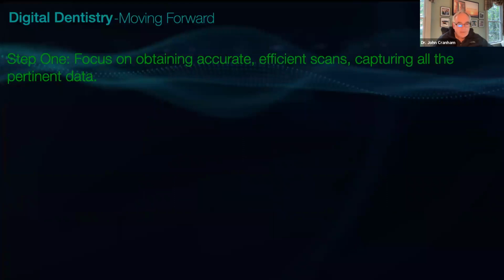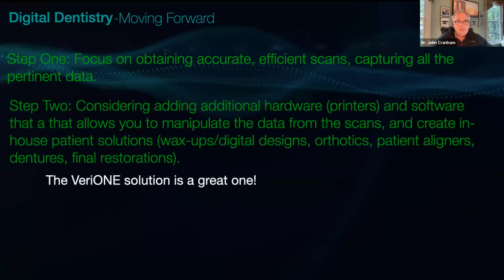What I would say moving forward is, I do think step one, if you're new to scanning or been at it for a little while, is focusing on obtaining accurate, efficient scans. Take some of the recommendations I gave you earlier, but you want to capture all the pertinent data. Just don't focus on speed. Get great at scanning, get your teams great at scanning, and you'll have a lot of fun with it. Step two is consider adding additional hardware like printers and software that allow you to manipulate the data from the scans and create in-house patient solutions, like being able to do your own wax up designs, orthotics, patient aligners, dentures, final restorations. There's so many things you can do.